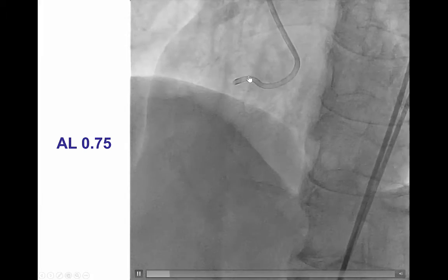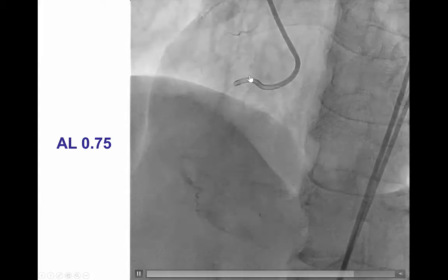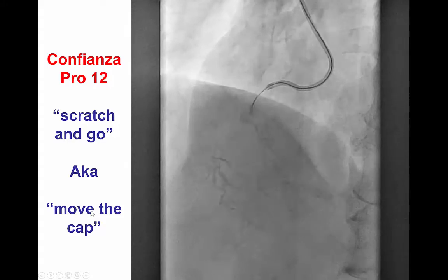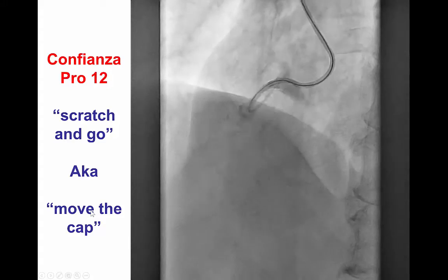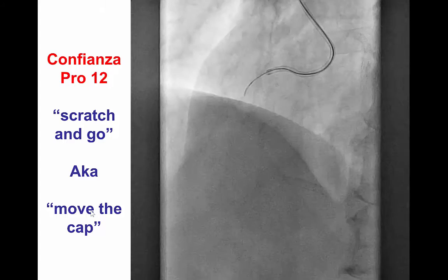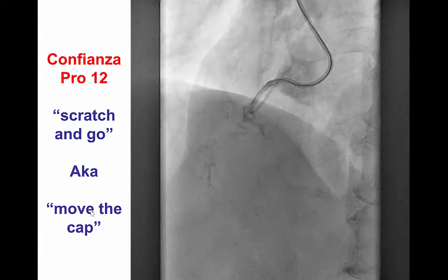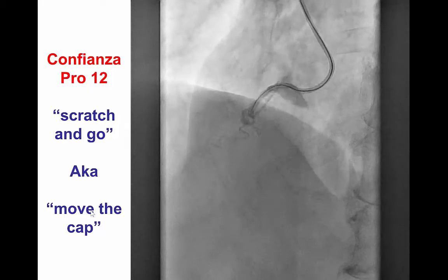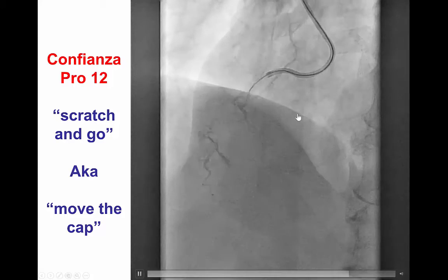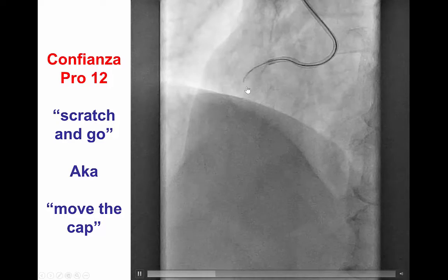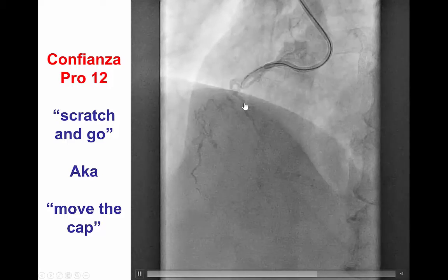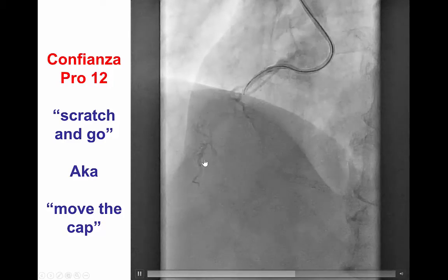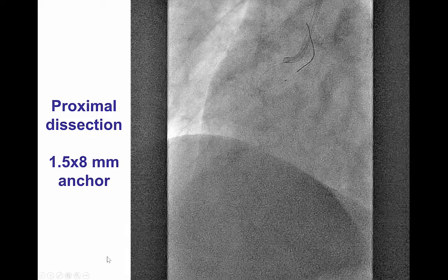We used various guides for challenge with guide catheter support — this is an AL.75. Given the inability to clarify the ambiguity using various projections, we used a technique called the scratch-and-go technique, in which we intentionally cause a dissection in the vessel proximal to the occlusion so that we can access the sub-intimal space and then cross the CTO in the sub-intimal direction.